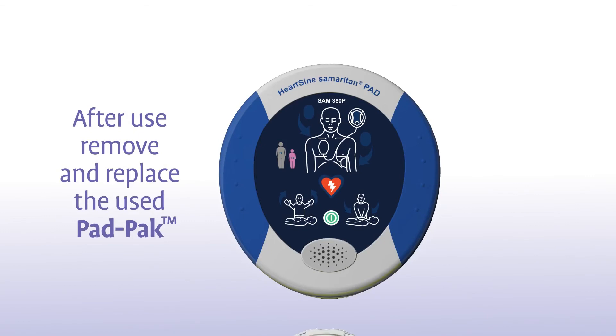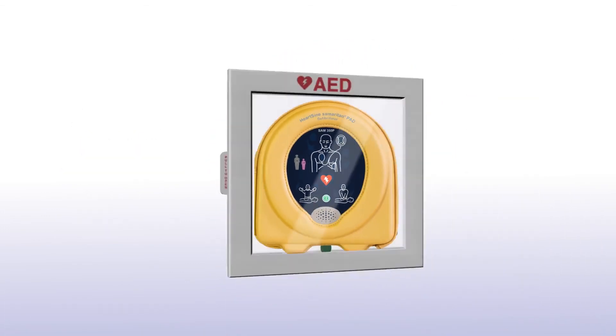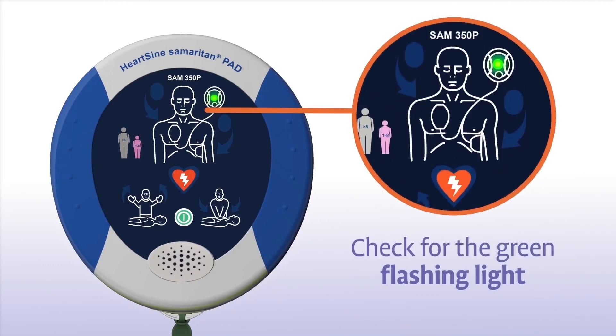After using the Samaritan PAD, slide a new pad pack into the unit and store it as usual. Remember to follow your local battery disposal guidelines. Once a week, check that the green light is flashing so that you know the unit is ready in case of an emergency.